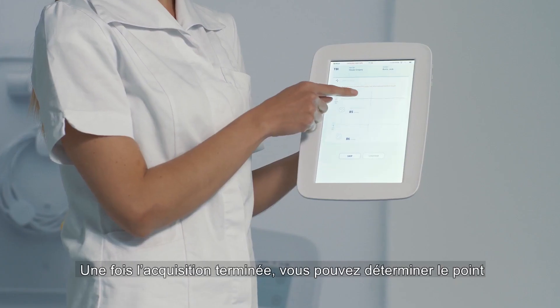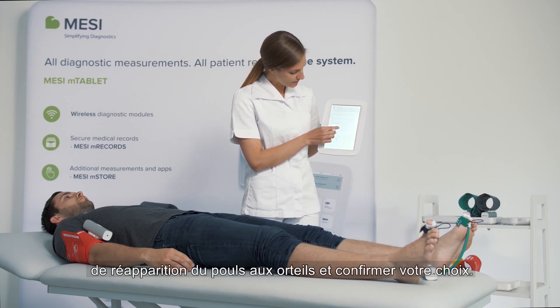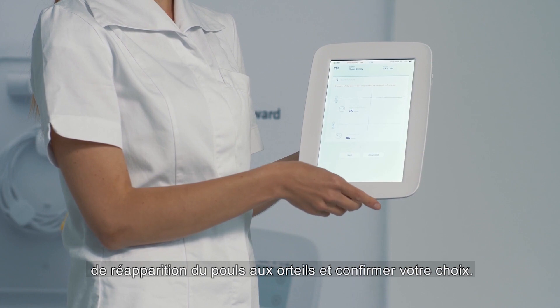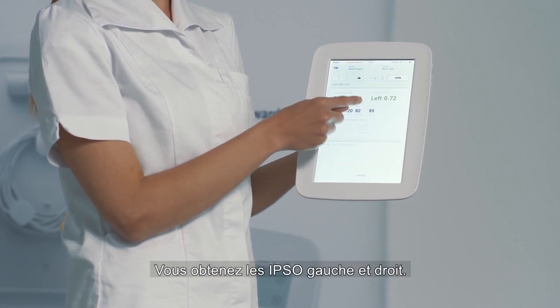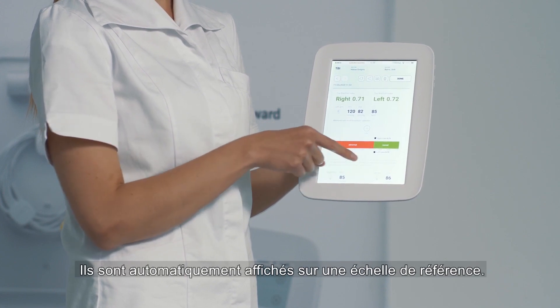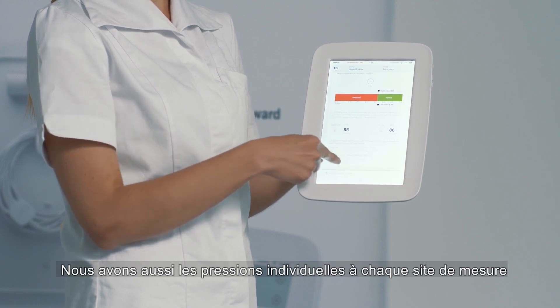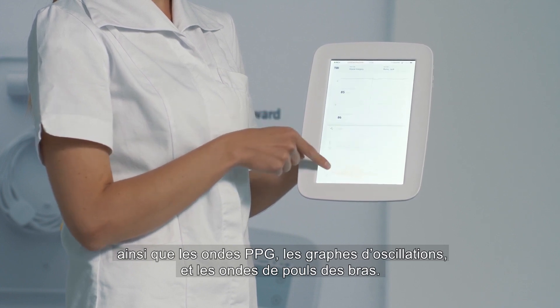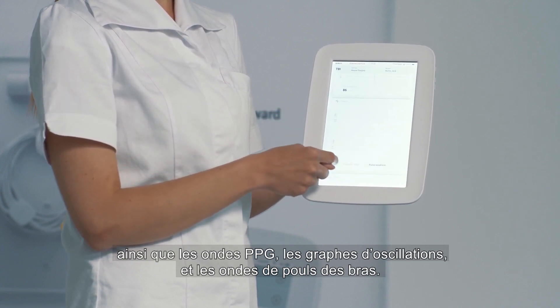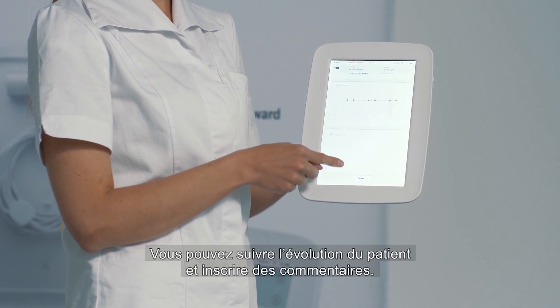After the measurement is concluded, you determine at which point the pressure is returned to the toes and confirm your choice. We receive the right and left TBI, which are automatically put onto the PAD reference scale. We also receive the individual pressures in each extremity, the PPG pulse waveforms, and the oscillation graphs for the arms with pulse waveforms. You can monitor patient trends and add any comments.